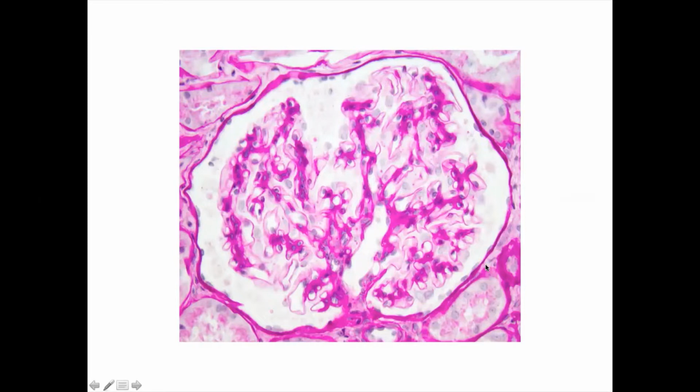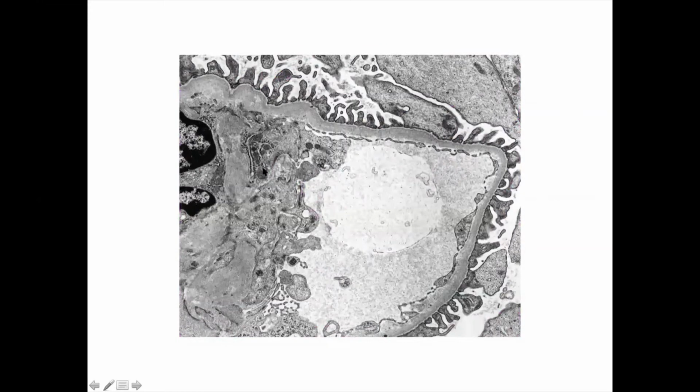From here we can't really talk a lot about tubules, but we have brush border, and they seem to be fine. We have brush border here, and everything is absolutely beautiful. This is our weekly revision of what a normal electron microscopy looks like.